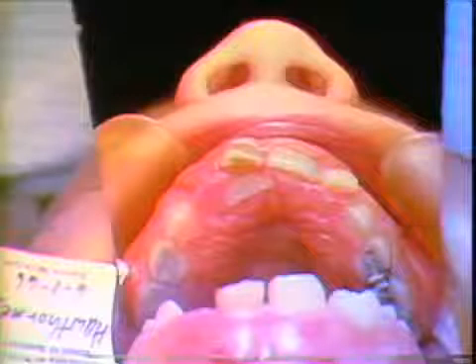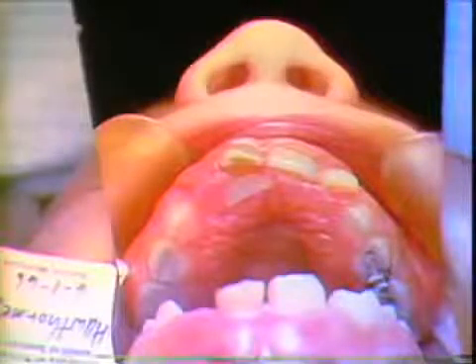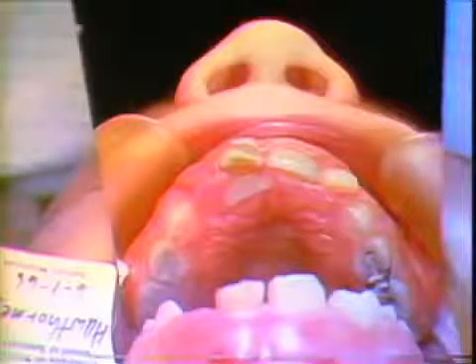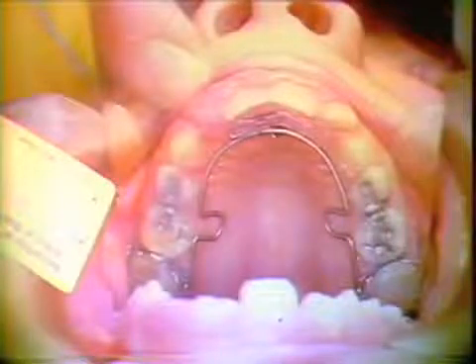You can see that the left central incisor is lingually displaced and the overlying primary tooth is still present. This shows the lingual arch in place with the auxiliary spring soldered to the anterior portion and in full activation against the lingual surface of the central tooth.